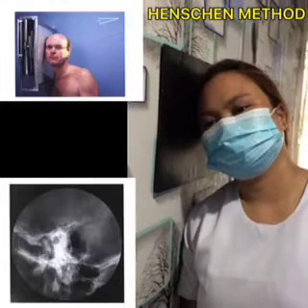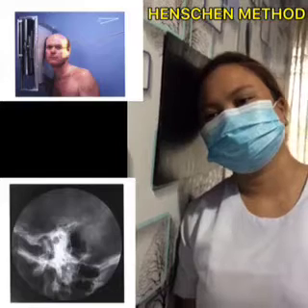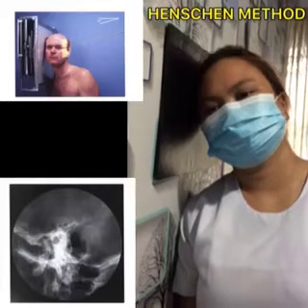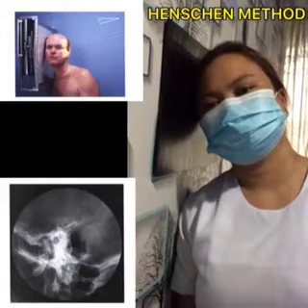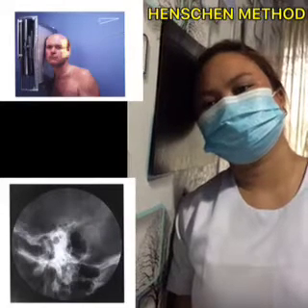Patient position. Place the patient in the prone position or, preferably, sit the patient before a vertical grid device. When the mastoid cells are the point of interest, tape the auricles forward.